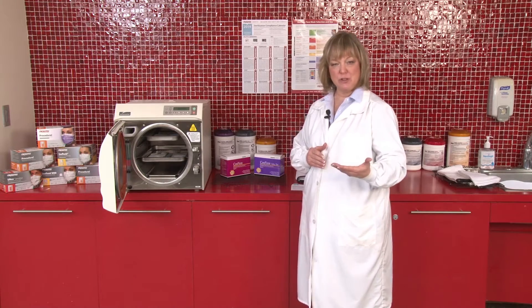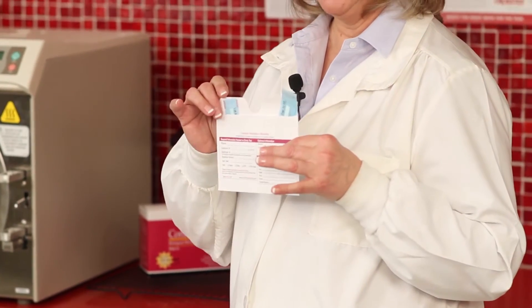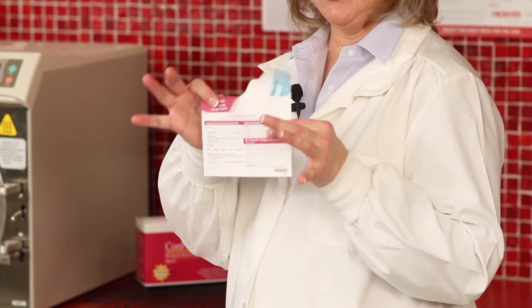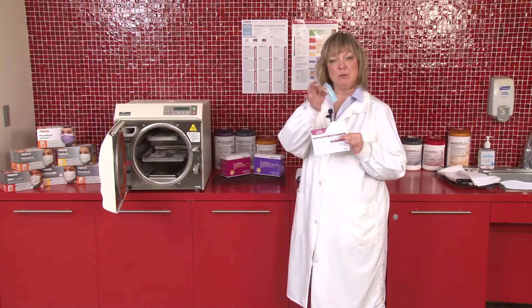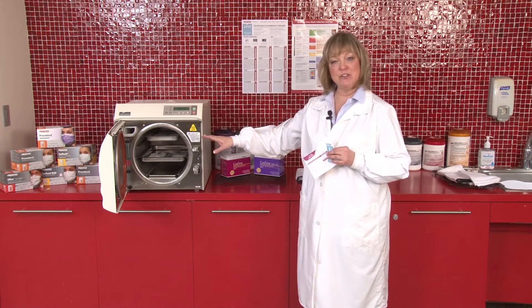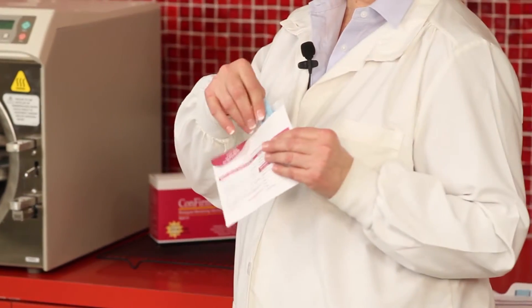For increased sterility assurance in your practice, you may opt to do a two-strip test. Just as with the other one, on the control side, that strip stays inside — it is not processed. The two strips will be removed from the test side of the envelope and placed in two challenge areas of the sterilizer, run through a normal cycle, and then placed back in for mailing.